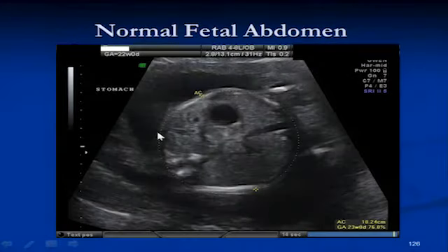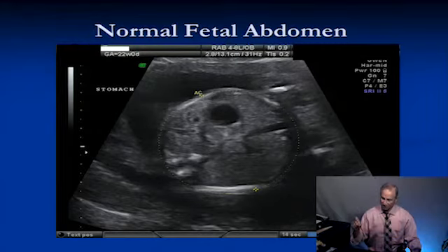To understand how the abnormal looks, let us see what is the normal. When you do abdomen circumference, when you do your measurements, your biometry, you did your head measurements, now you go into the abdomen. What do you need for fetal size? The baby's head, abdomen, and femur, correct? The Hadlock or other formula will depend on those three. So you have the head, biparietal diameter, head circumference, and then the abdomen circumference and femur length.